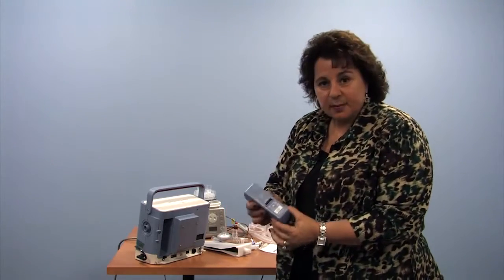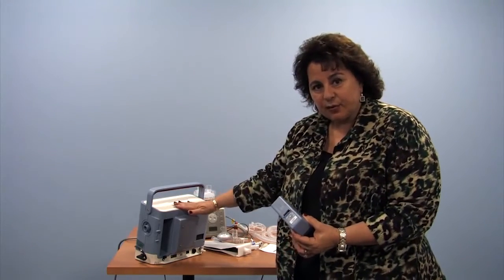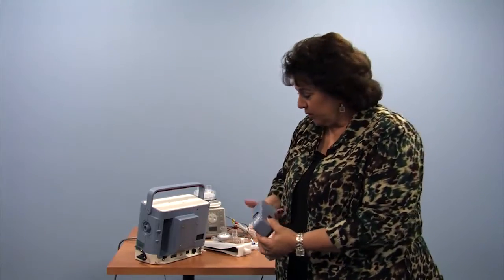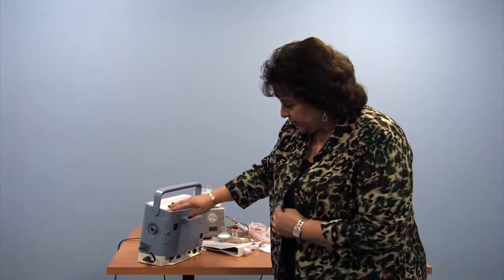I can press the button and I can see that this battery is full based on the green lights. This is approximately 3 hours of use. Within the machine is another 3 hours of battery power. So in total, this snaps in and we have 6 hours of use of life for the machine.